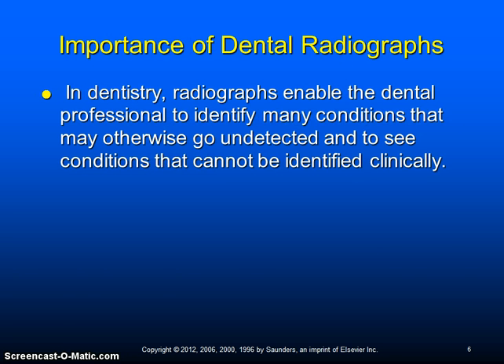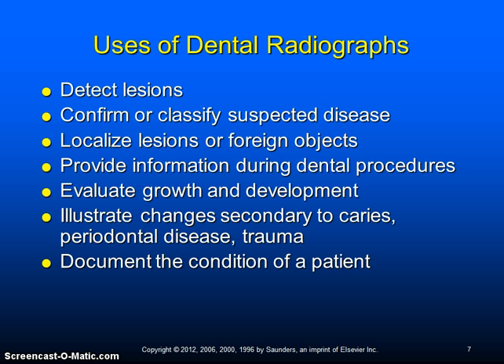In dentistry, radiographs enable the dental professional to identify many conditions that may otherwise go undetected and to see conditions that cannot be identified clinically. Many dental diseases and conditions have no clinical signs or symptoms and may go undetected without the use of dental radiographs. Dentists should weigh the benefits of dental radiographs against the risk of increasing a patient's exposure to radiation.